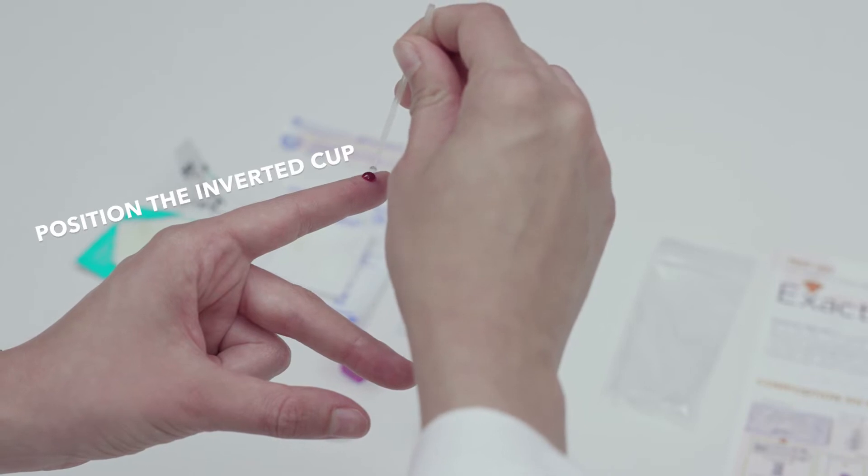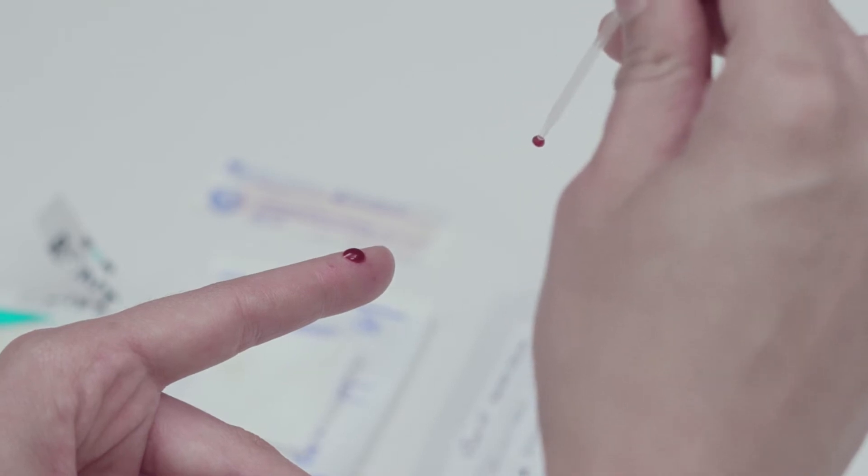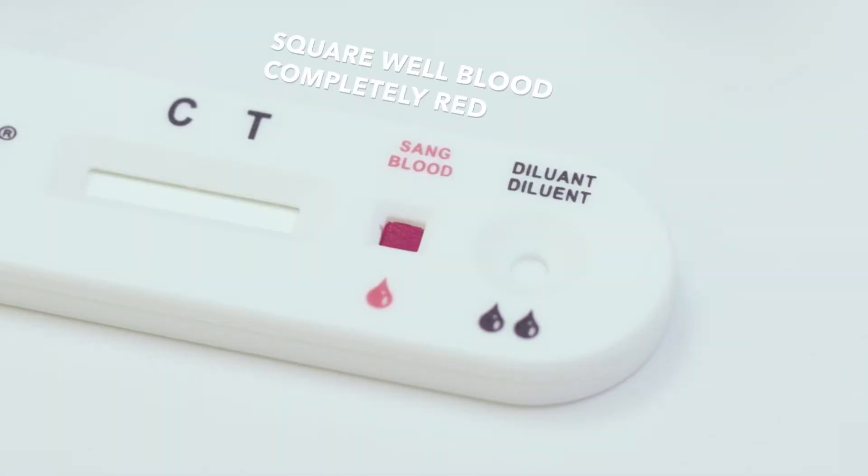Position the inverted cup vertically with the wide end on the drop of blood to fill it completely. Place the drop of blood into the square well. Make sure the bottom of the square is covered completely in red.